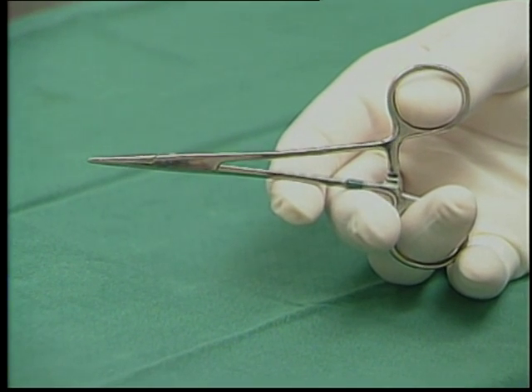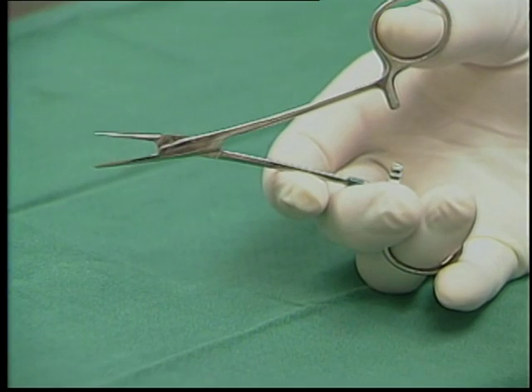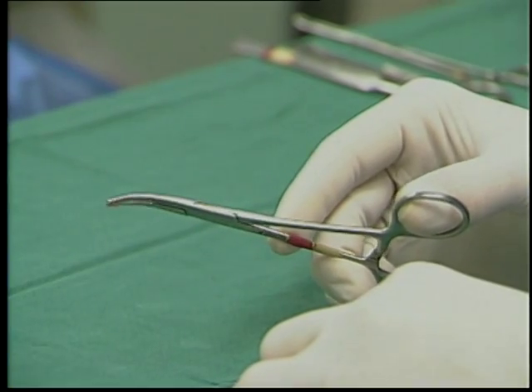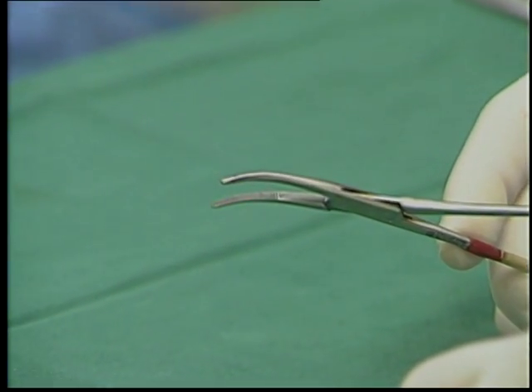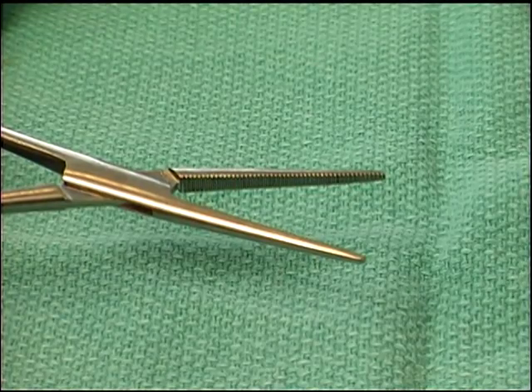Hemostatic forceps are designed to squeeze off blood vessels and control bleeding. For small blood vessels, mosquito hemostats are used. For larger blood vessels, Kelly and Crile forceps are commonly used. Note how the teeth of these Kelly forceps extend only halfway down the instrument, whereas they extend down the full length of the Crile forceps shown here.